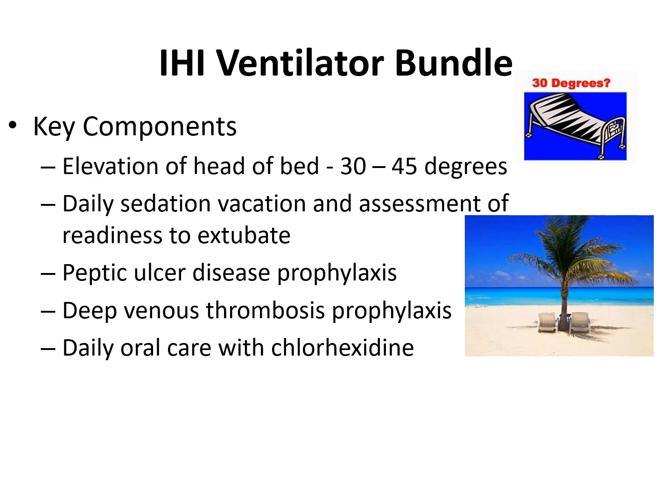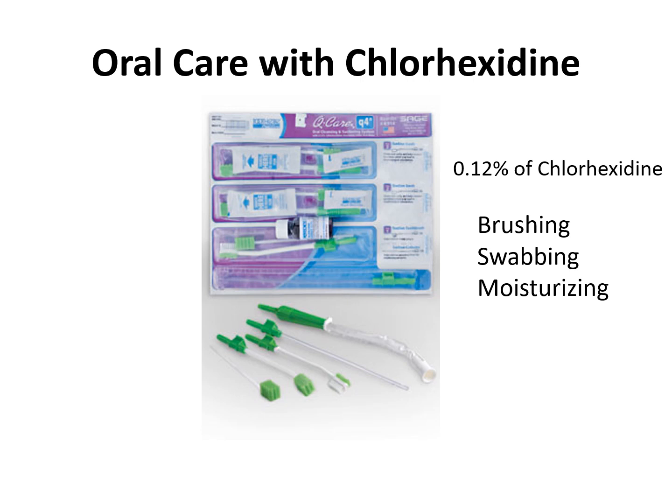Daily oral care with chlorhexidine. There's usually these nice little oral care chlorhexidine packets with 0.12%, which gives you the opportunity for brushing the teeth, swabbing, and moisturizing, and usually there's a packet that's a 24-hour packet. Once this 24-hour packet is done, you can get another packet for the next 24 hours. So these are meant to be used throughout the day in a 24-hour period. You may have your own specific routine at whatever hospital you're at.